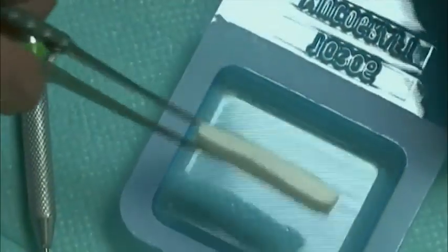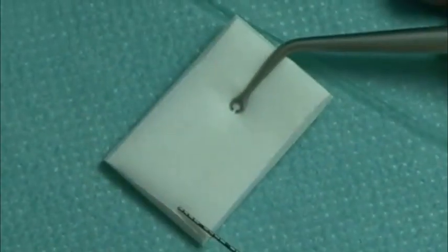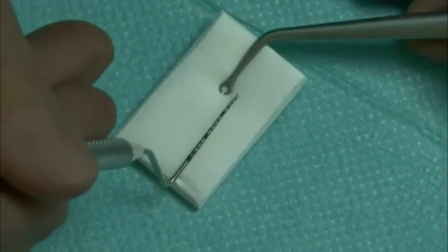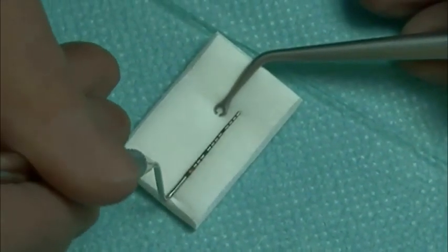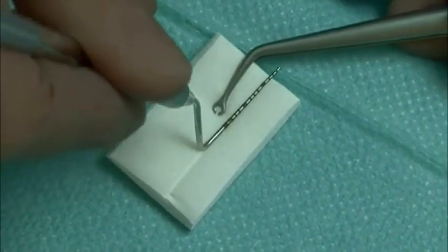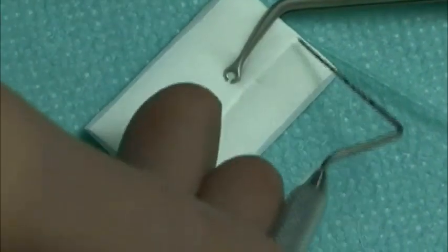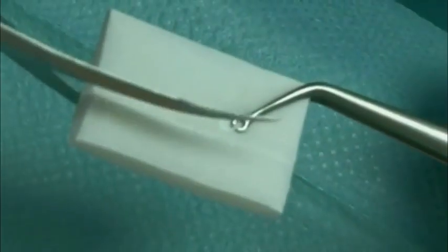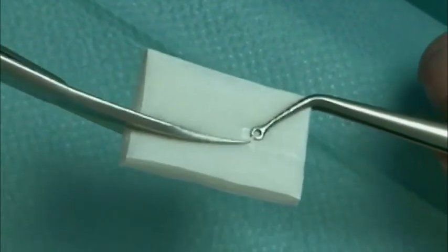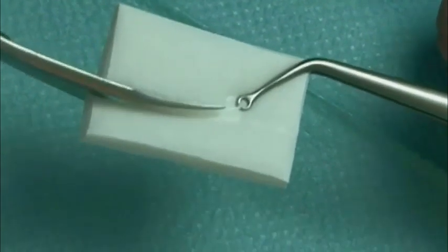Geistlich Mucograft is removed from its package, taking care not to compress the matrix. It is a unique 3D collagen matrix designed specifically for soft tissue regeneration as an alternative for autogenous grafts. In this surgery, Geistlich Mucograft is used with the coronally advanced tunnel instead of the connective tissue graft, eliminating the need for harvesting tissue from the patient. The device is measured and cut to a size of 7mm wide and 30mm long in dry state.